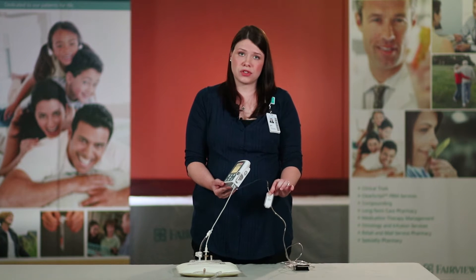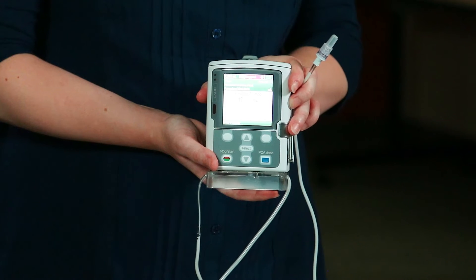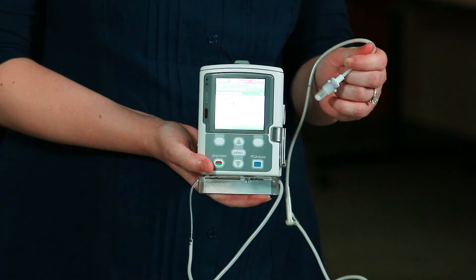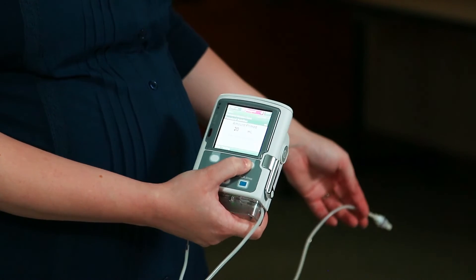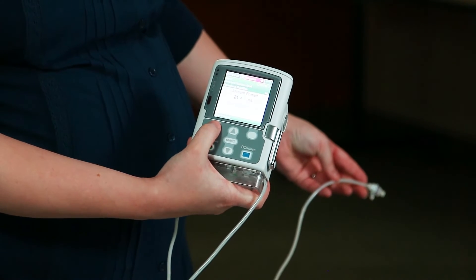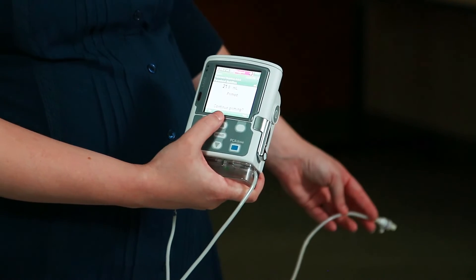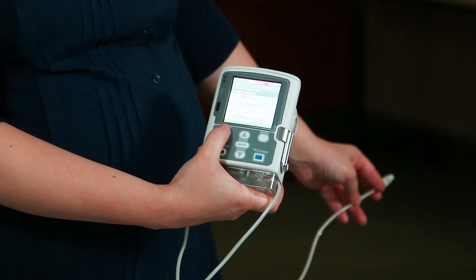You also want to ensure during this process that the filter attached to your tubing is in an up and down orientation. After your pump has finished priming with the 20 mils, occasionally there is some air left in the tubing. If you notice any air, you want to continue priming — press 'yes' and this will automatically prime with another 20 mils. Once the air is removed from the tubing, press 'stop priming,' then press the soft key under 'no' when asked to continue priming.